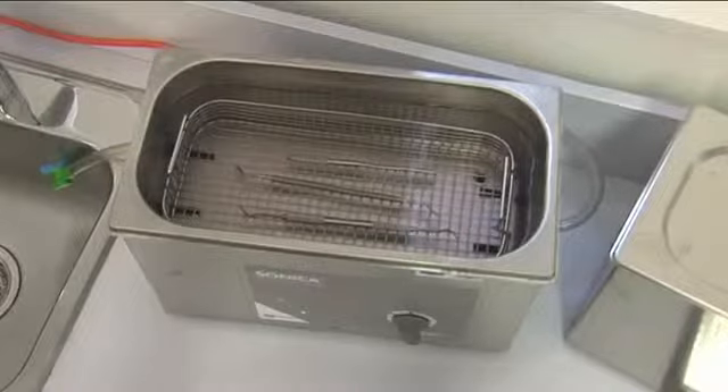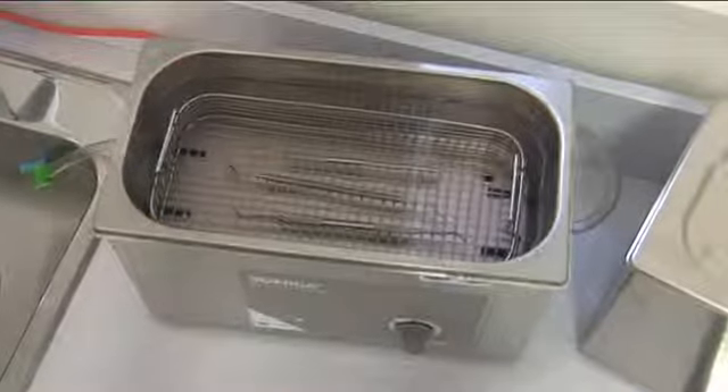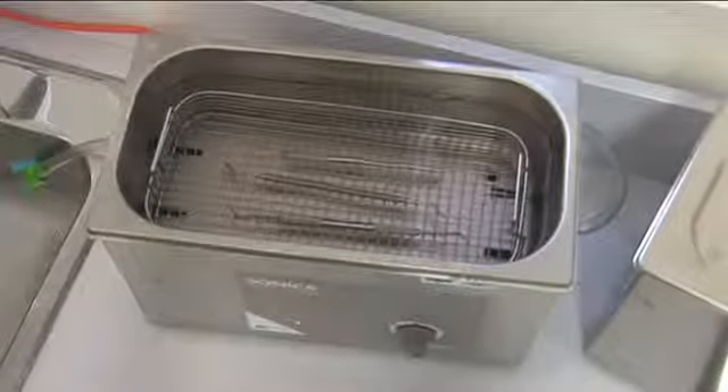Each crystal oscillator is individually tuned to the one-piece stainless steel tank, which reduces heat and noise while maximizing cleaning power.